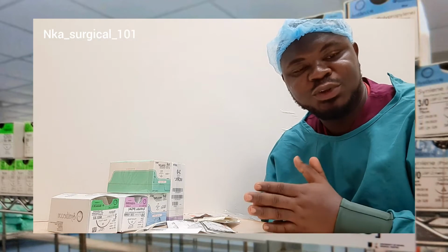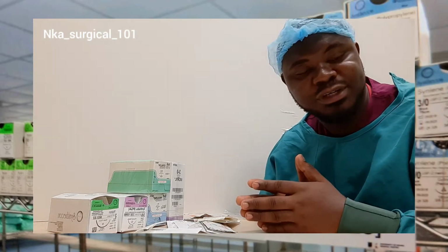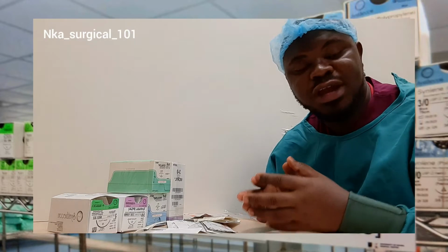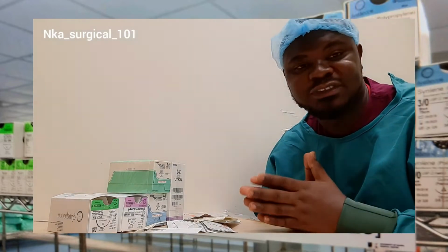Today on this episode, we are going to make surgical sutures very simple. We are going to break it down into the simplest way for everybody to understand. When we are talking about surgical sutures, we have two main groups that we use in theaters. One, absorbable suture, and two, the non-absorbable suture.